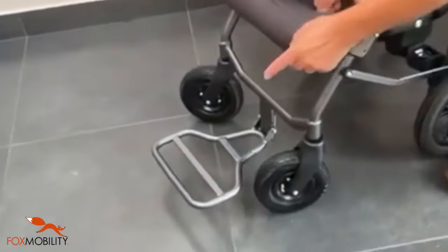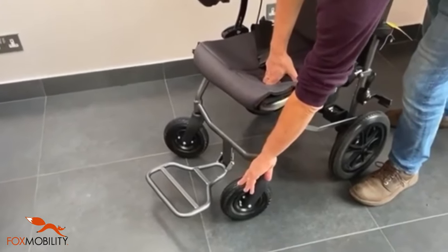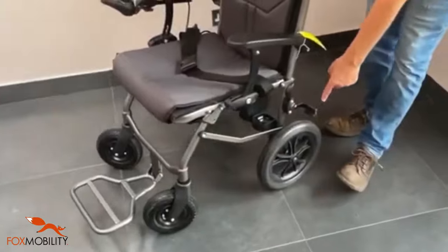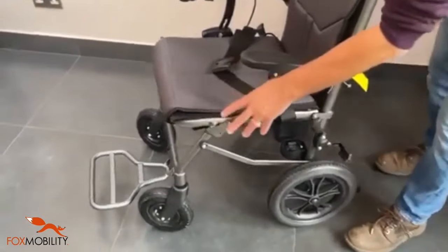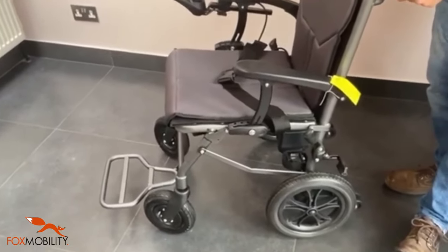At the front you've got some height adjustability with the footrest, and you've also got pneumatic tyres. At the rear you've got solids, but because of the size of the tyres you can be comfortable in some reasonably rough terrain.